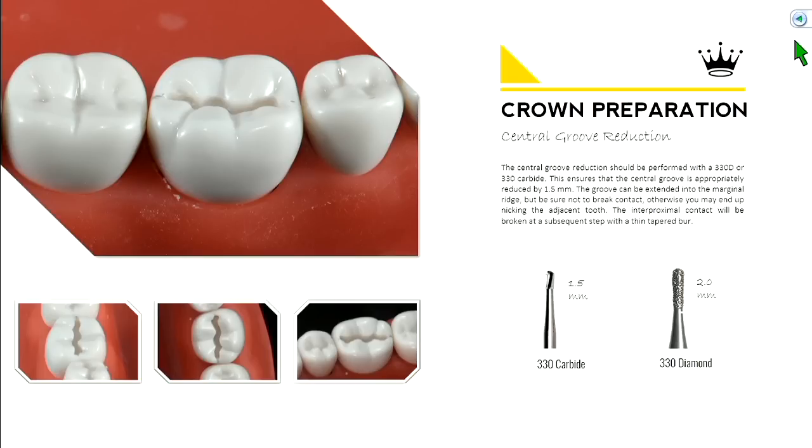Central groove reduction is performed with either a 330 carbide or a diamond burr. The carbide is about 1.5 millimeters in length and the diamond is about 2 millimeters — pick your weapon of choice. If using a diamond, don't go the full depth; go three-fourths of the depth, because we're trying to get 1.5 mm uniform reduction on the occlusal surface. Place the burr into the central groove, extend it out into the marginal ridge, but don't hit the neighboring tooth. This establishes a trough right in the middle of the tooth as a guide for reducing the remaining tooth structure.